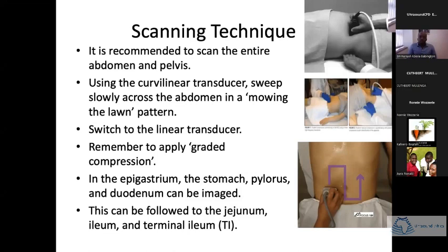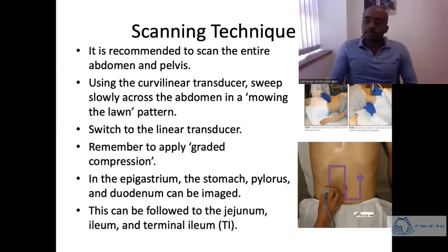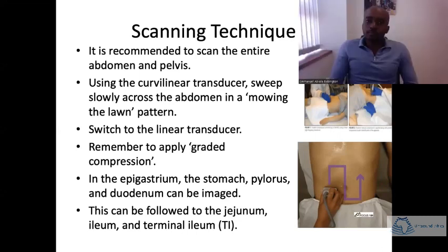The patient will have either pelvic pain or lower abdominal pain. We have to scan everywhere first, make sure we rule out ovarian cysts and other problems very often, and rule out all other possible causes of pain in the abdomen before we then focus on the bowel. So when you're done scanning the abdominal organs, then it's better to look at the bowel.